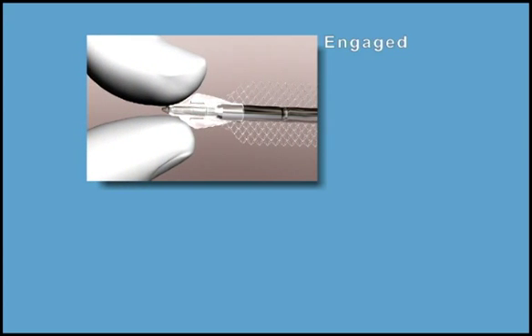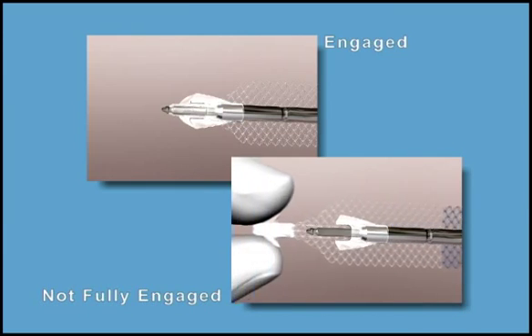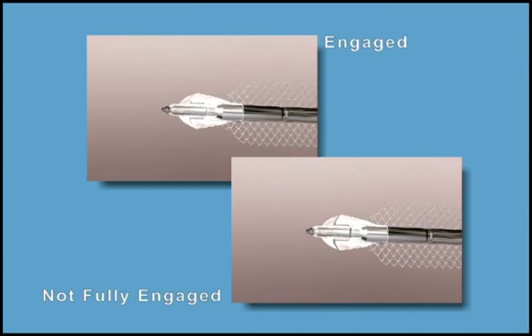When loading the sling tip, make sure the needle and sling tip are fully engaged and no space remains. You may feel a tactile sensation or snap.